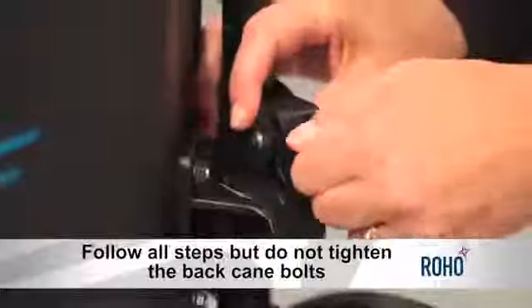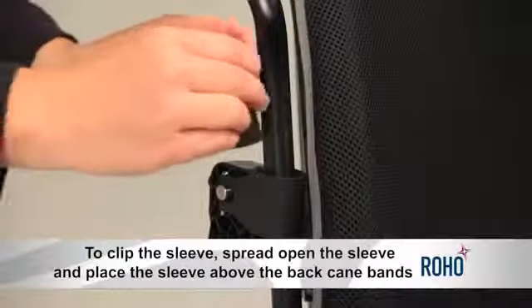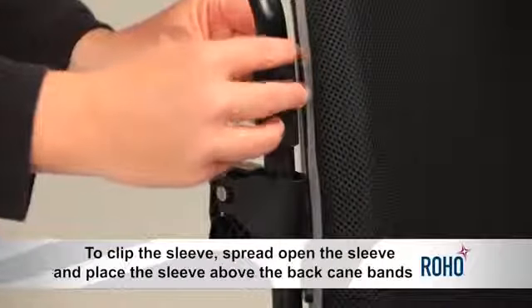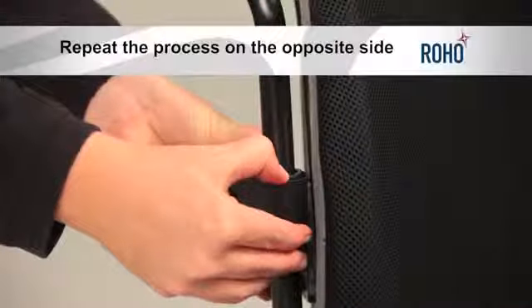We will demonstrate. Once you have the back cane bands attached, clip a sleeve onto each wheelchair back cane. To clip the sleeve, spread open the sleeve and place the sleeve above the back cane bands. With the back cane band loosened but still attached, slide the sleeve down inside the band. Repeat on the other wheelchair cane. Then tighten the hardware bolts on each side by hand to secure the back in place.